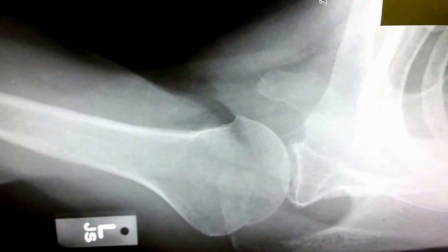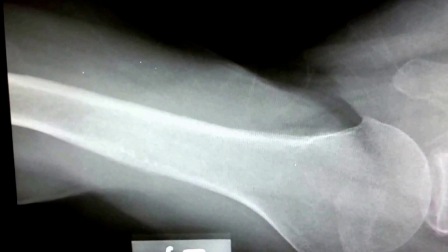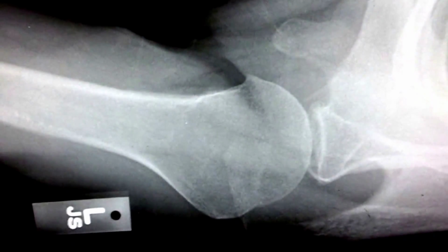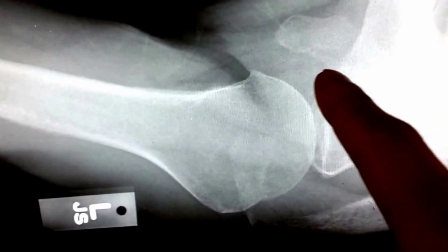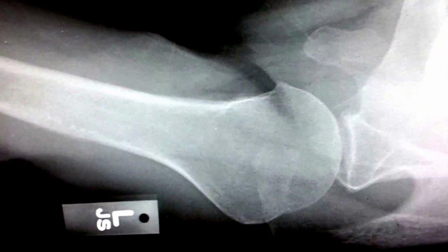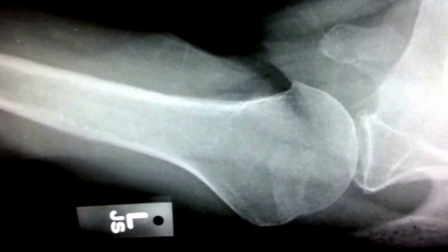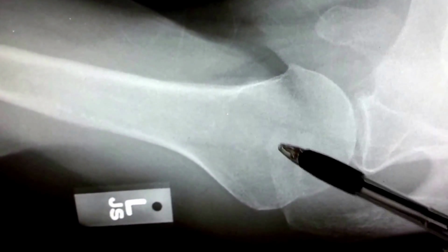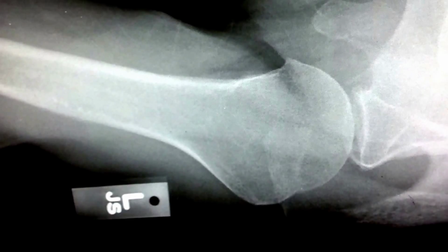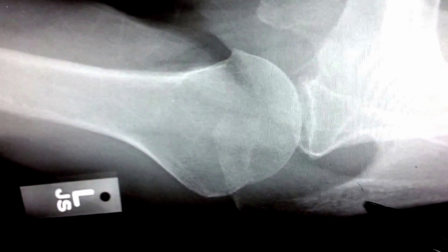Alright guys, here we have the superior inferior axial view of the shoulder. As you can see, we have an open scapulohumeral joint, and we have the coracoid process projected above the clavicle right there. We have the lesser tuberosity in profile. You can see that one right there. And the acromioclavicular joint through the humeral head right there. And the soft tissue surrounding the axilla with the bony trabecular detail there.